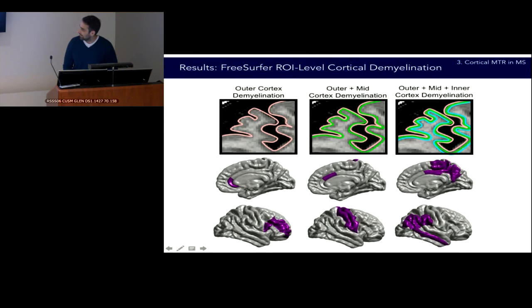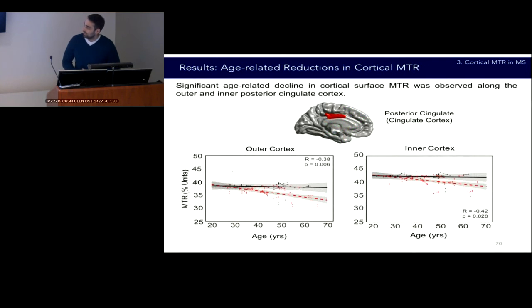One of the interesting things about this is that these areas of the brain are involved in default mode connectivity, executive function, and processing speed. So MS patients tend to show quite a large deficit in these. So an intriguing area that different people are looking at is zeroing in on these regions and looking at whether the reduction in MTR, your myelin sensitive metric, is causative of cognitive dysfunction, specifically in the executive function and processing domains.